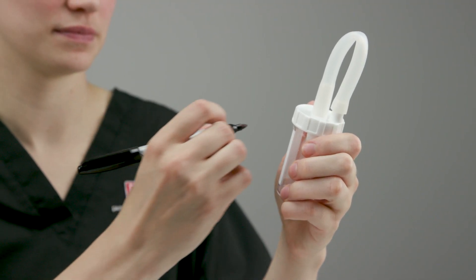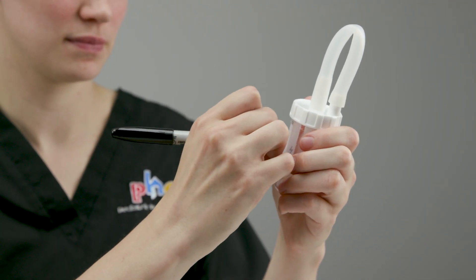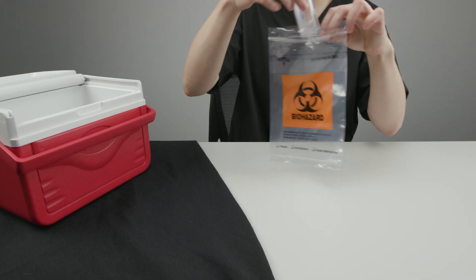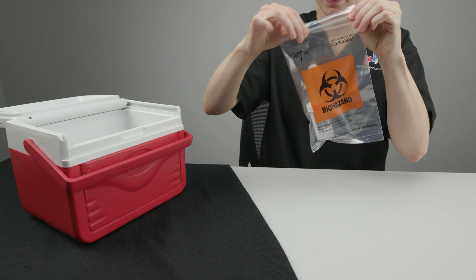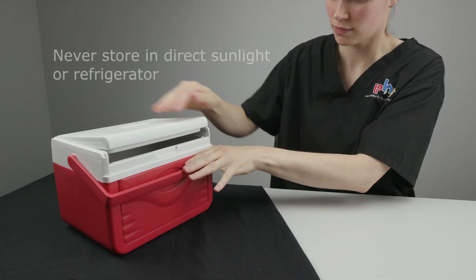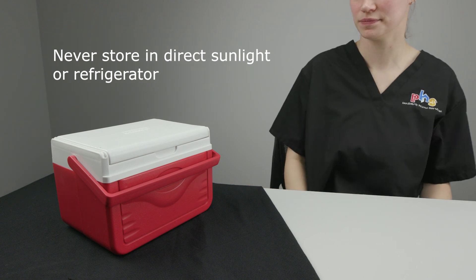Label the specimen container with the information your laboratory requires. Send the sample to the lab as soon as possible. Store the sample at room temperature before and during transport. Never store the sample in direct sunlight or in the refrigerator.